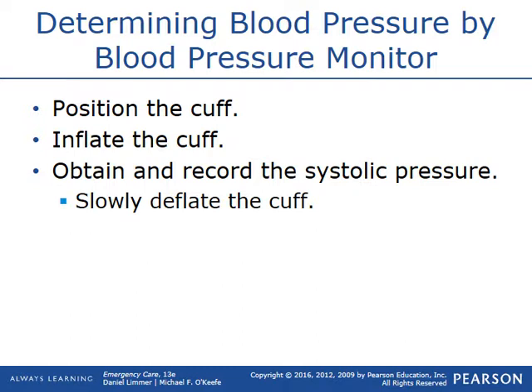If you're going to use a monitor to determine a blood pressure, position the cuff and inflate the cuff. Obtain and record the systolic blood pressure, and then slowly deflate the cuff.